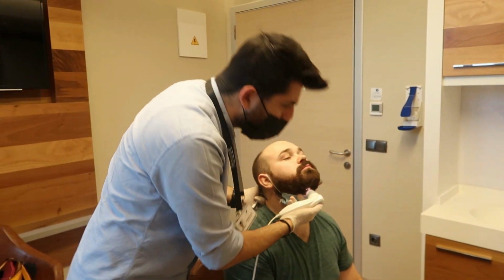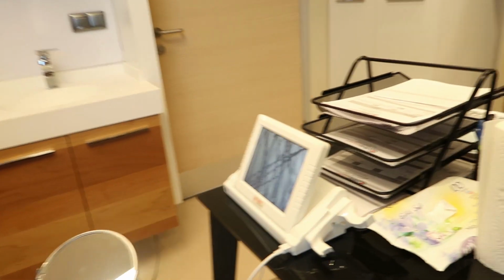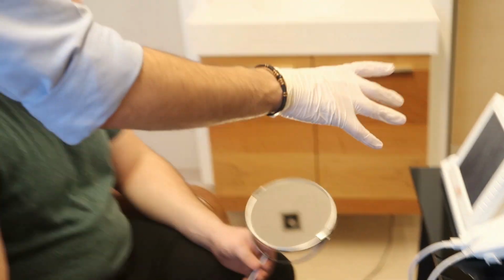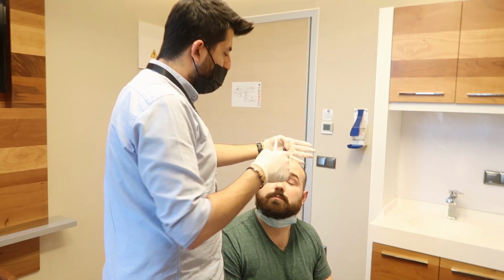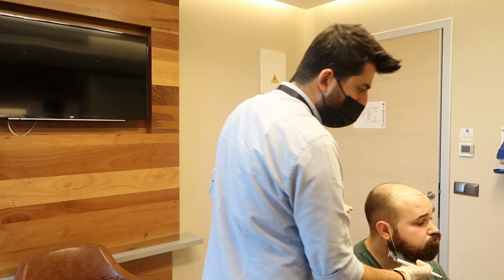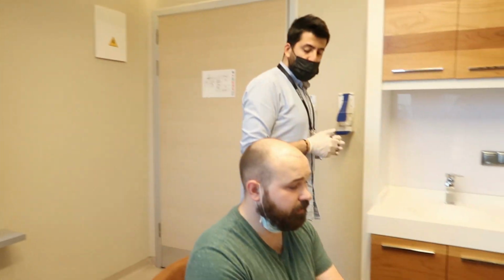In some patients, if the beard is strong, we can use these grafts too, mixing with the donor area. Your beard grafts are so thick, thicker than your donor area. So if you want, we can use these grafts in the same session within that area, so we can increase the density that way. We can harvest maybe 400 to 500 grafts from that part, and we will implant them for that area. What do you think about that?